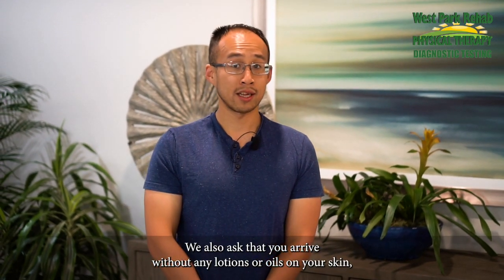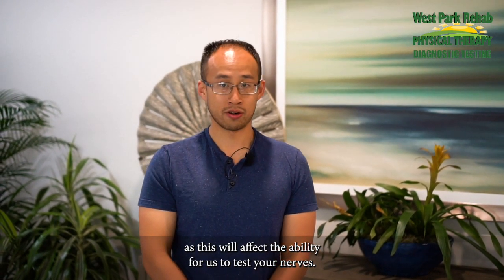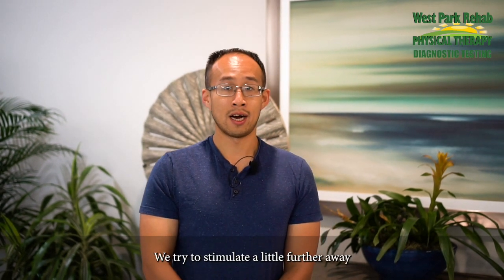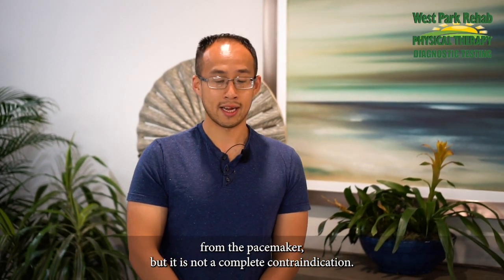We also ask that you arrive without any lotions or oils on your skin, as this will affect the ability for us to test your nerves. If you have a pacemaker, please let us know. We try to stimulate a little further away from the pacemaker, but it is not a complete contraindication.